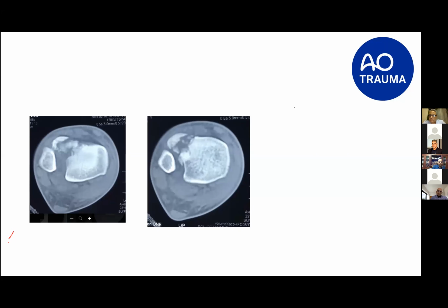In these cases, as we will see later on in some other cases, I would start off with the arthroscopy as an assessment tool and know where to start, medially or laterally, and know if I have intra-articular debris. Especially here, you have an osteochondral fragment, which you might be able to fix even percutaneously, and it would reduce the degree of the open procedure. You might be able to do that with a clamp percutaneously and then fix a Herbert or a headless screw.